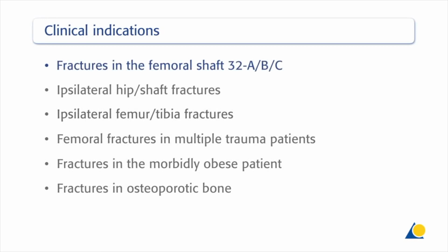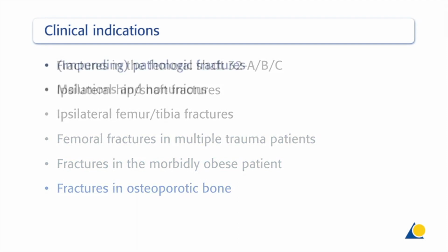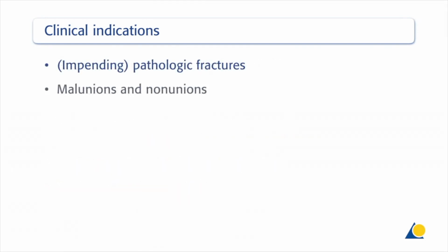in the femoral shaft 32A, B, C, ipsilateral hip shaft fractures, ipsilateral femur tibia fractures, femoral fractures in multiple trauma patients, fractures in the morbidly obese patient, fractures in osteoporotic bone, impending pathologic fractures, and malunions and non-unions.